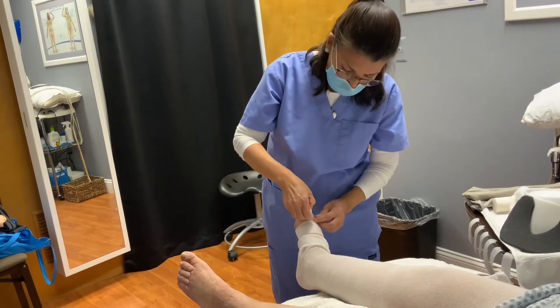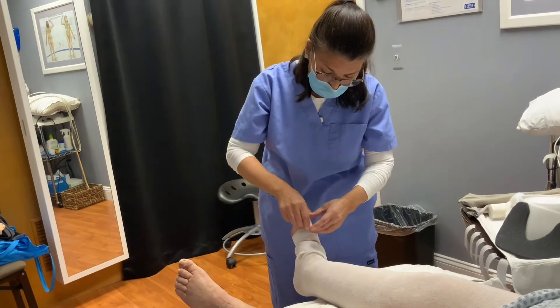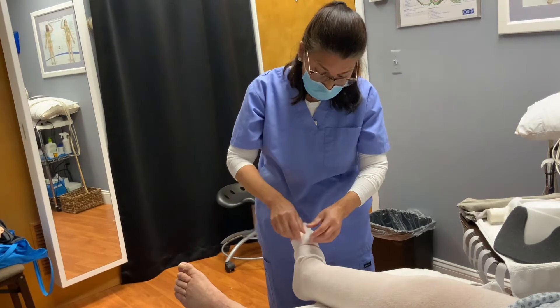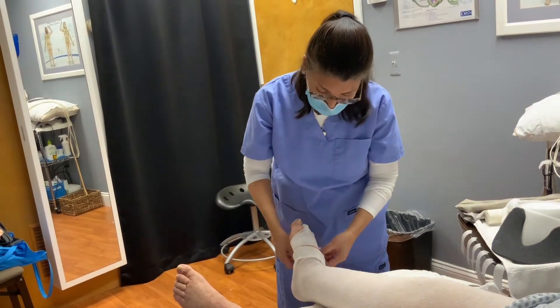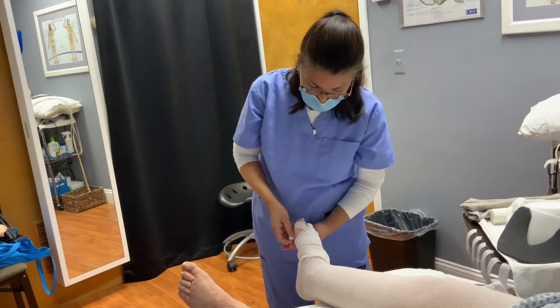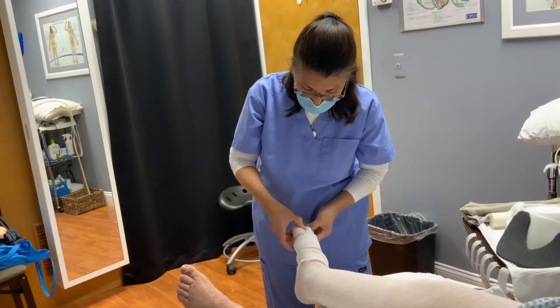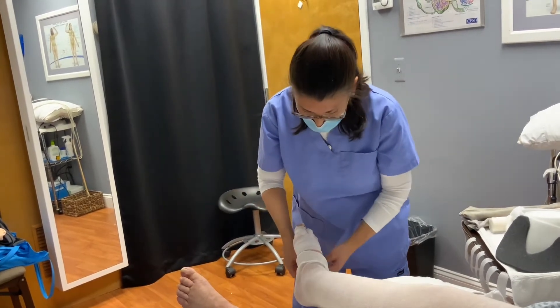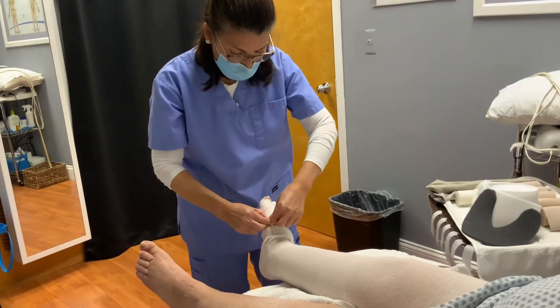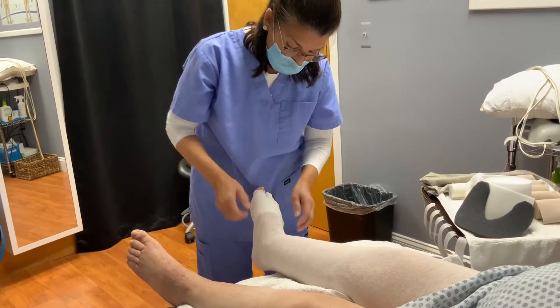A lot of other therapists start at the big toe and leave out the little toe. If there is swelling, you want to contain the small toe as well. Then we come on up to the big toe, cover it all, and there you tuck it under or you can tape it. I find that tucking it under is fine.